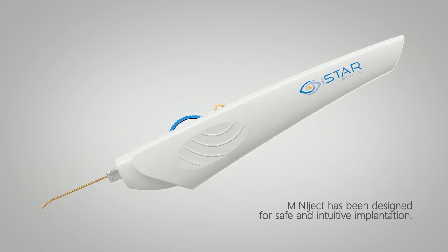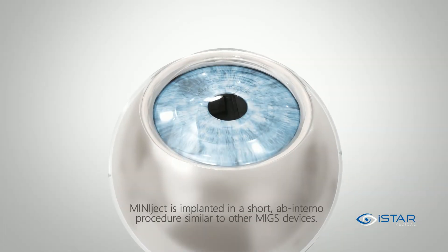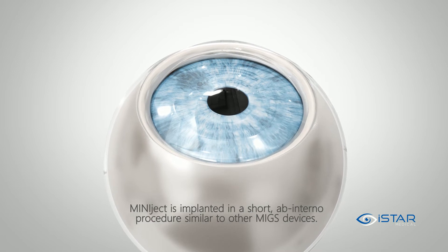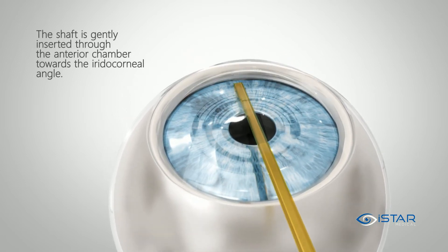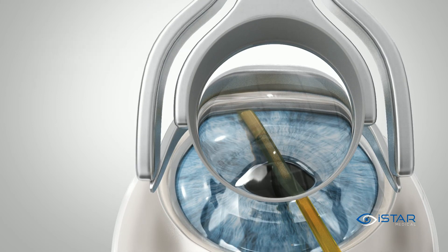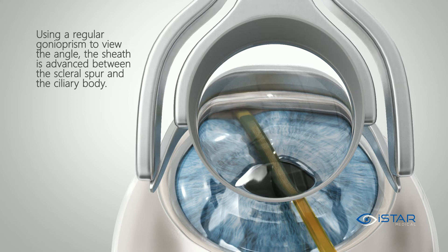Miniject has been designed for safe and intuitive implantation. It is implanted in a short ab interno procedure similar to other MIGS devices. The shaft is gently inserted through the anterior chamber towards the iridocorneal angle. Using a regular gonio prism to view the angle, the sheath is advanced between the scleral spur and the ciliary body.